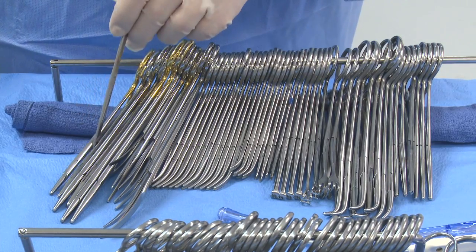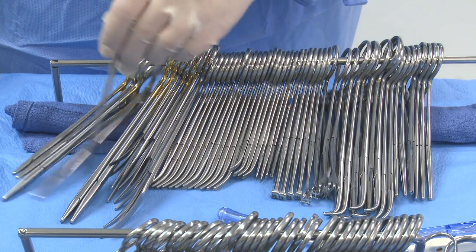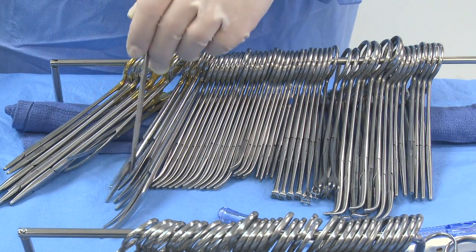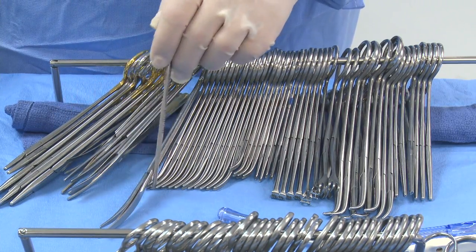I'm going to count needle holders: 1, 2, 3, 4, 5, 6 needle holders. Then 1, 2, 3, 4, 5 scissors.